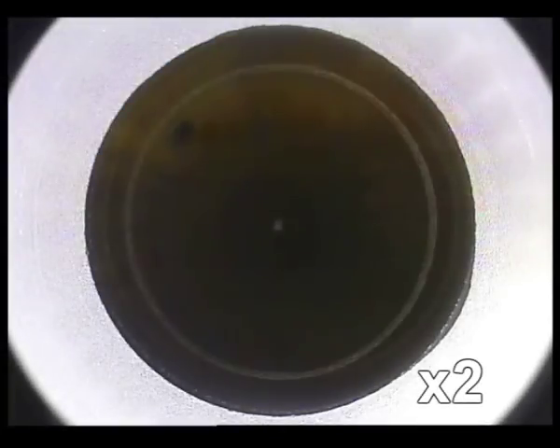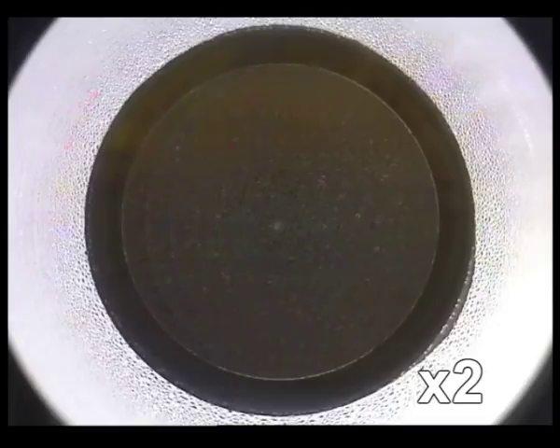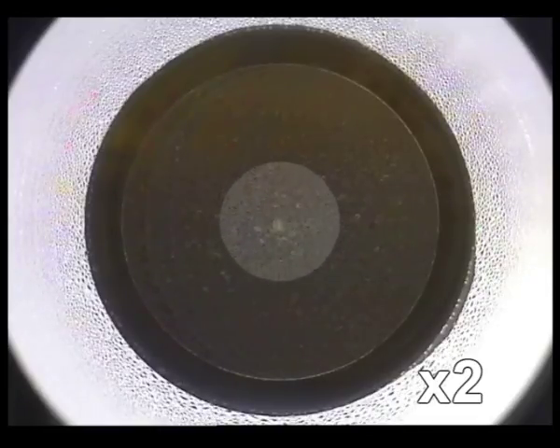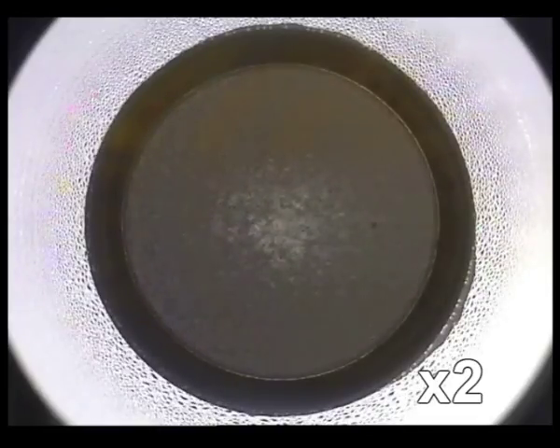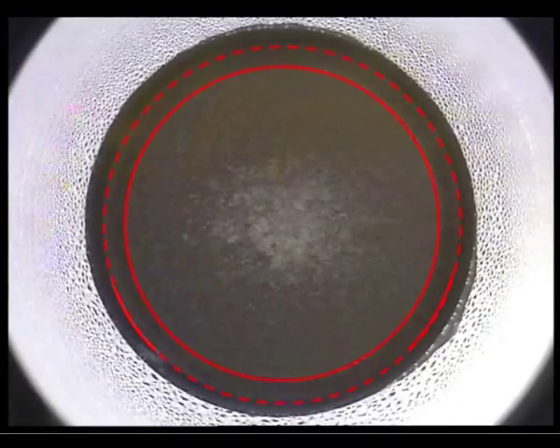RELEX SMILE is a keyhole form of keratomileusis, essentially a flapless LASIK procedure. A high-precision femtosecond laser is used to cut a three-dimensional refractive lenticule within the body of the stroma, which is then linked to the corneal surface by a 2 mm tunnel incision.